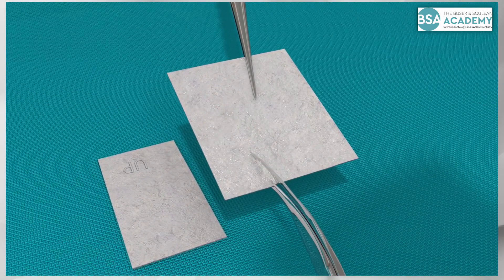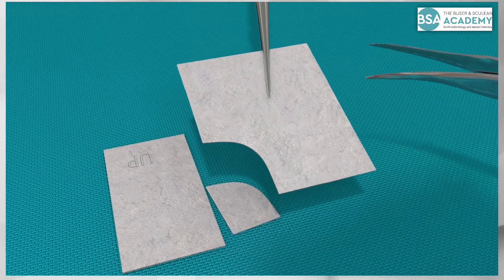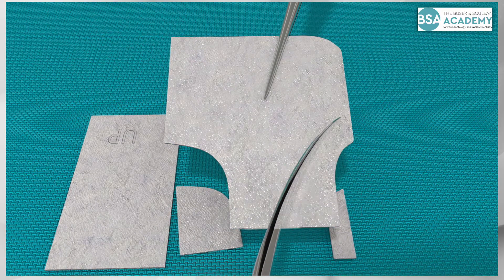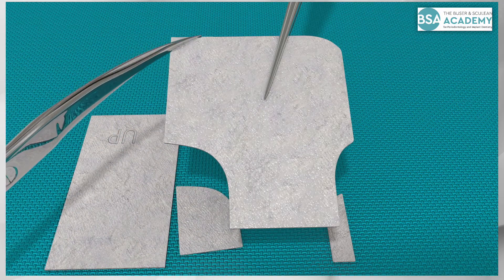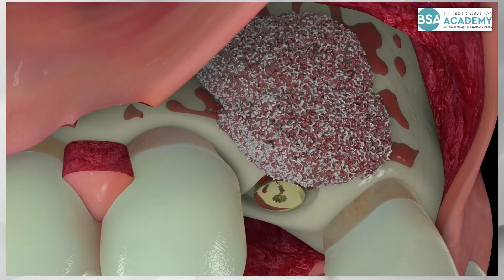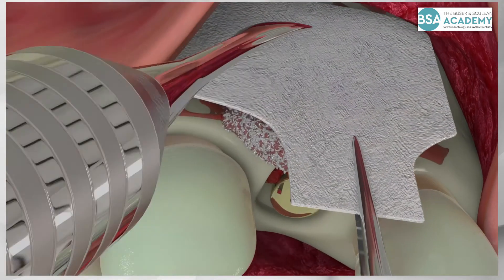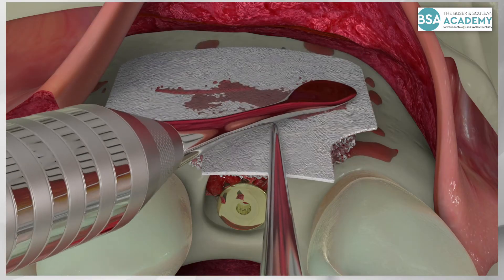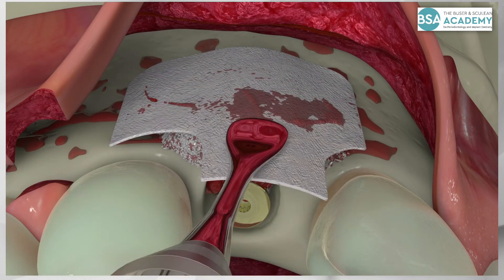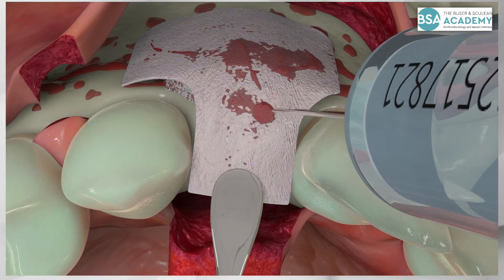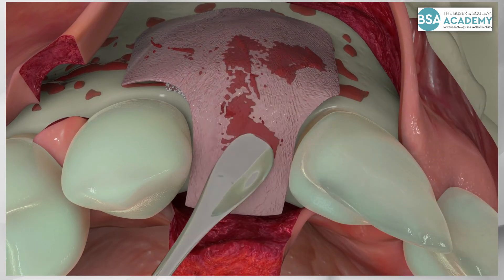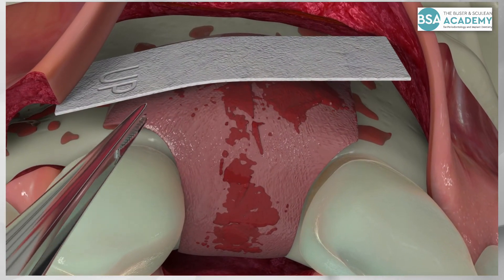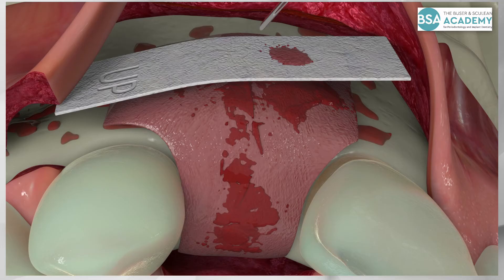A critical step for a GBR procedure is the utilization of a barrier membrane. A collagen membrane is cut into two pieces — a larger and a smaller one — and trimmed to shape. Collagen membranes offer several advantages: they are easy to apply when soaked with blood, and when moistened with bone-conditioned medium, the membrane becomes soft and adhesive, easily adapted to the local bone anatomy. The second membrane strip improves the membrane thickness in the defect area and improves the stability of the membrane.